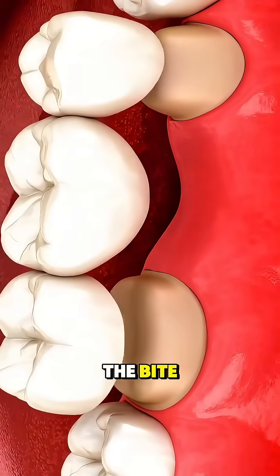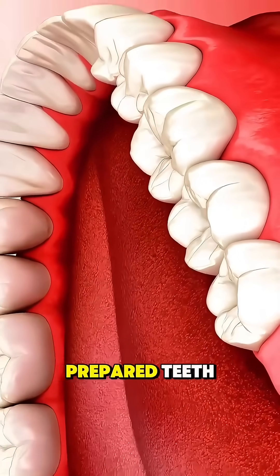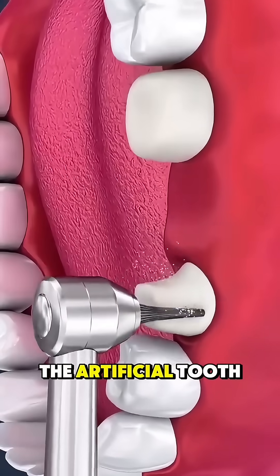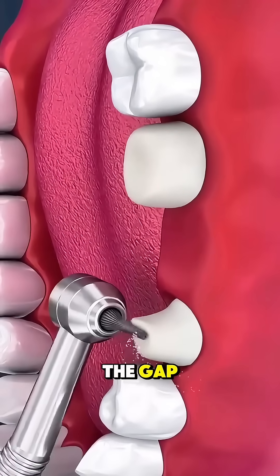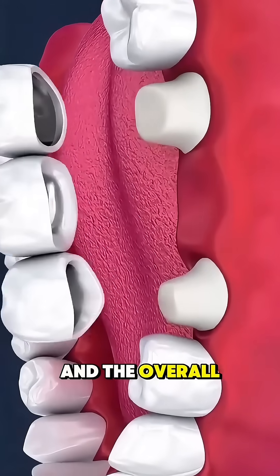The dentist checks the bite, makes sure it feels natural, and then cements the bridge securely onto the prepared teeth. With everything polished and aligned, the artificial tooth sits perfectly in the gap, restoring your smile, your ability to chew, and the overall support of your bite.